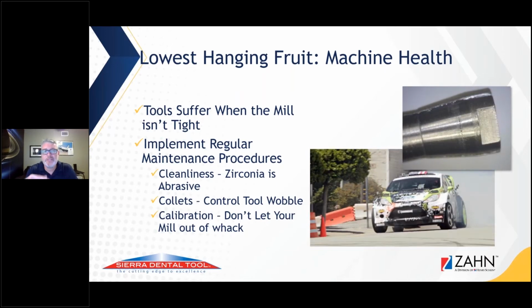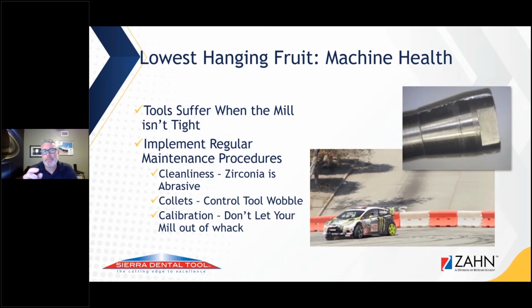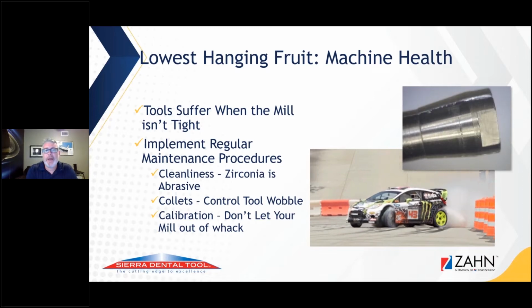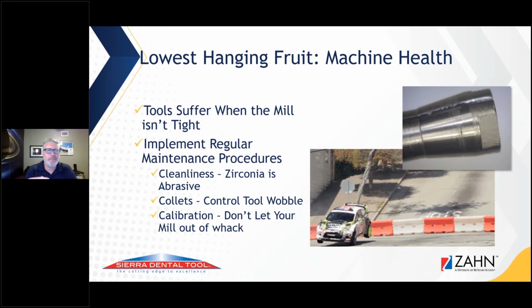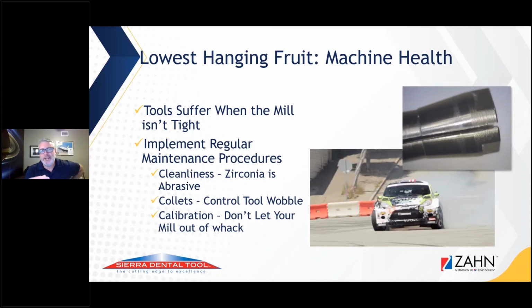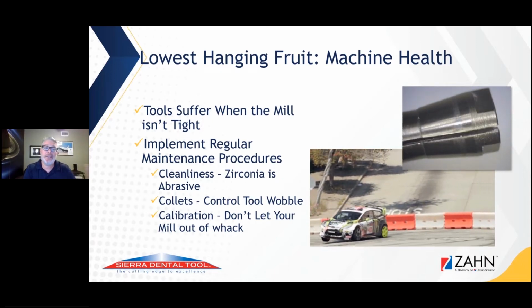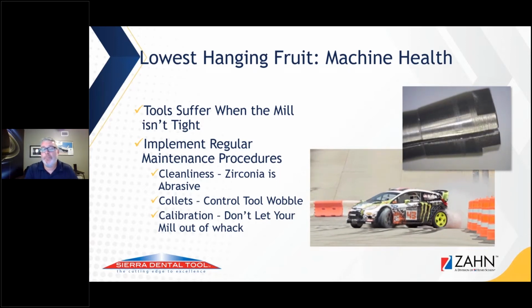Like the collet that's rotating right now in the picture, that's worn out. So what's going to happen is the tool itself starts vibrating, and then your units are getting bad. So we replace the tools, seems to be going fine, but then the tool life is even shorter the next round. So the big thing that happened is we got collet wobble. It's starting to oscillate and get worse and worse and worse, and it can actually affect the machine itself, the spindle, the fixture. It has a vibration, can take out a ball screw.